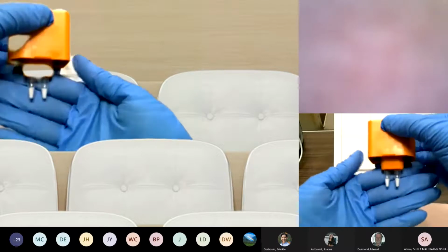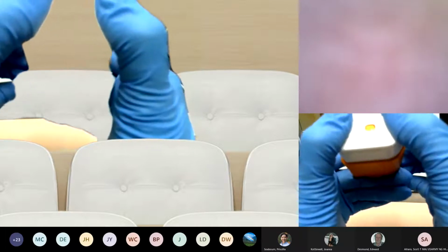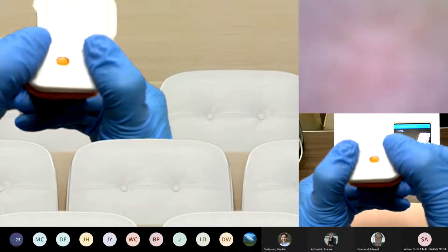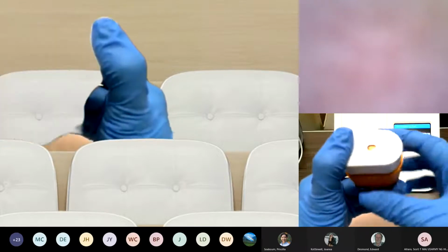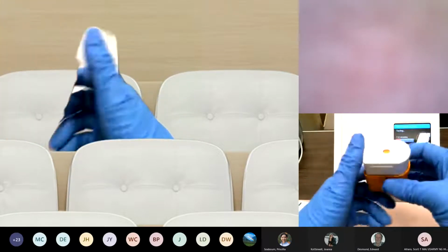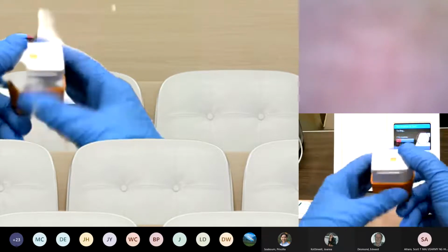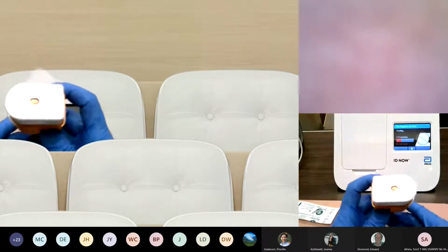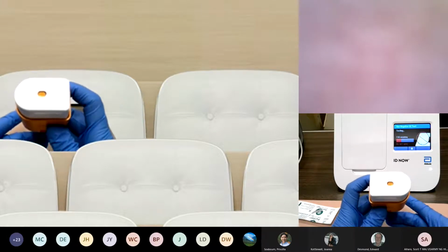Look down below, there's still dry reagent. Let's push down a little bit further. There we go. There was one more click. If you didn't hear that click, just believe me, there was a click and there's still powder at the bottom. So many people think that, oh yeah, it's ready to go. The instrument's telling me to close the lid, or that it's going to start the test. But if it looks like this, indicator's still up, you're going to get an invalid result or a failed QC.